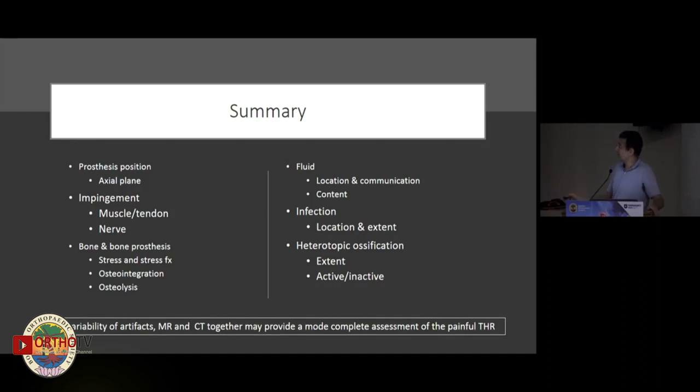To summarize quickly, we can help with prosthesis position, impingement of structures, the bone-prosthesis interface, fluid characterization, infection, and heterotopic ossification, among other things. The take-home message is that following a radiograph, MR and CT are probably the best next steps in evaluating patients, especially those with significantly challenging and non-obvious clinical findings. Thank you.